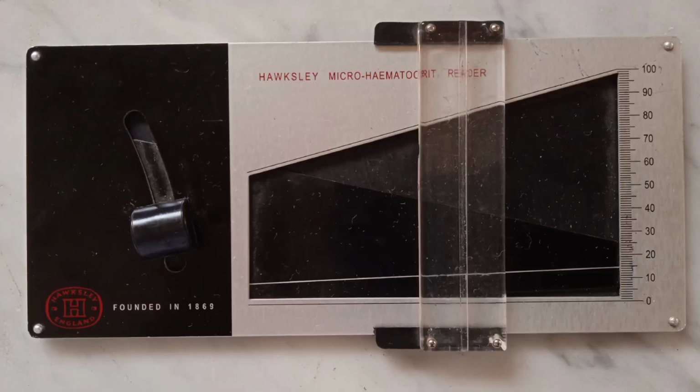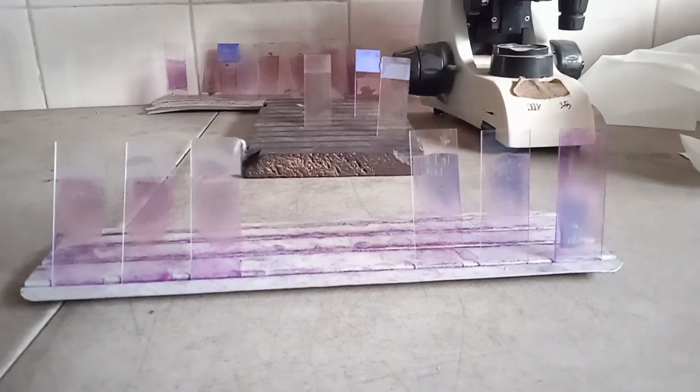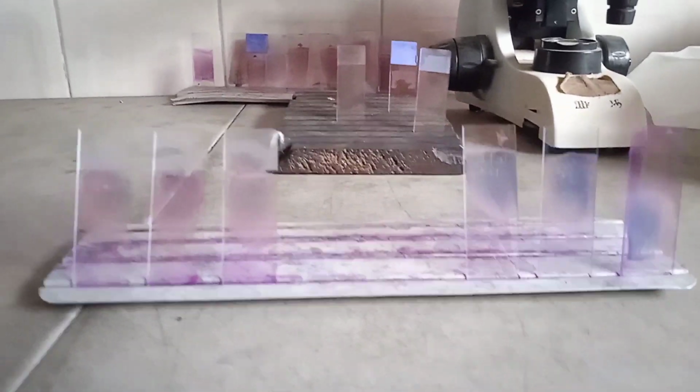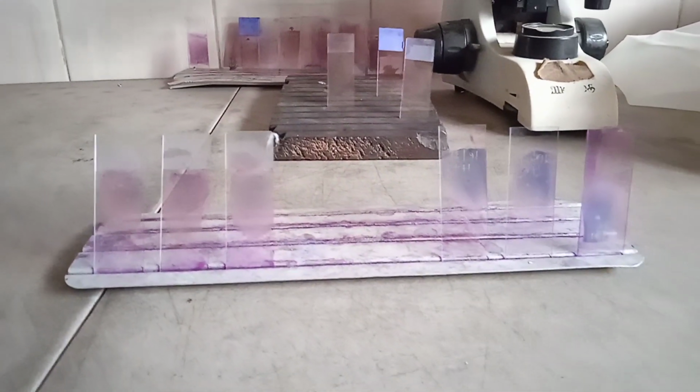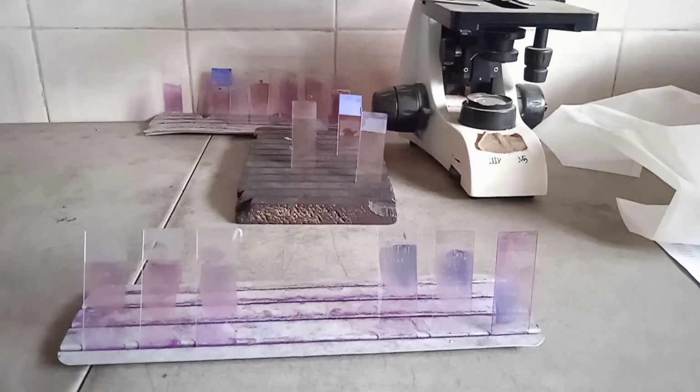Here and under. So this is our hematocrit reader for reading the PCV, that is the packed cell volume, and this is our stained slide. You can have the thick film and the thin film here. They are both stained to check the cells for malaria parasites and all that.